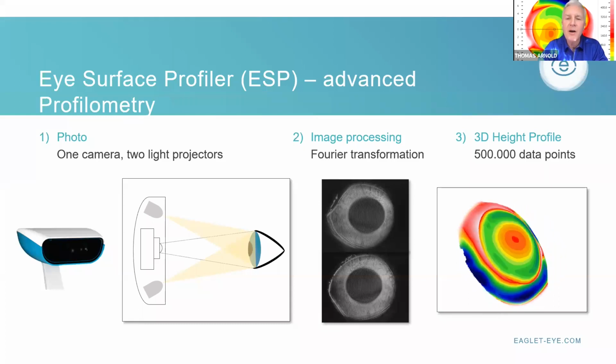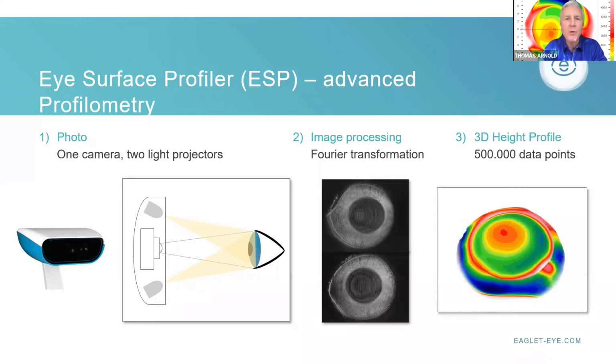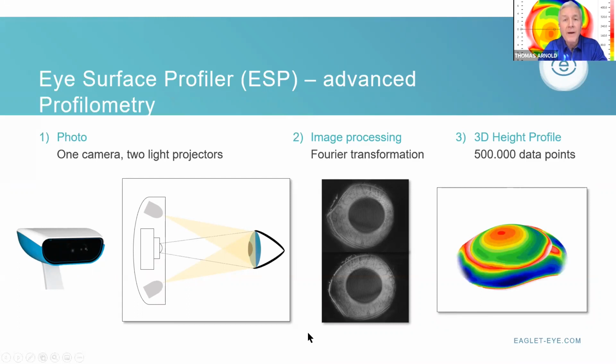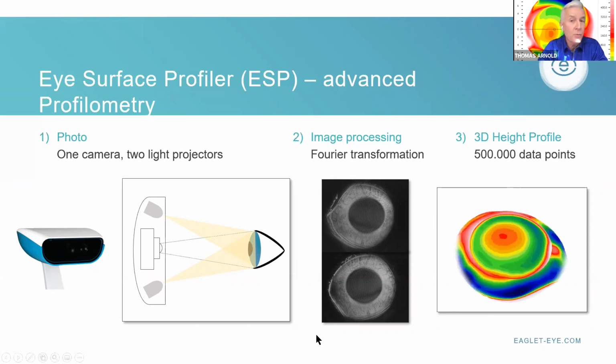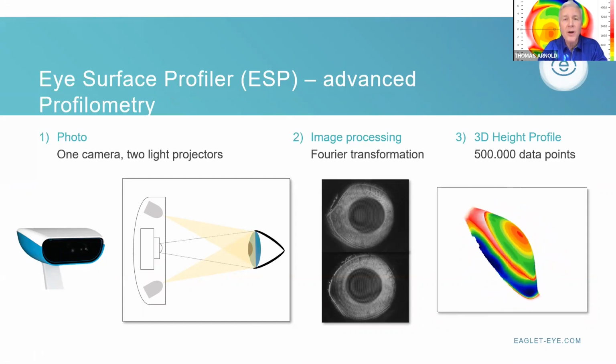So you spend a lot of time trying to figure out, well, how am I going to fix this, why isn't this lens centering, and why isn't this patient comfortable? And looking at this image, right off the bat, you see the complexity of this patient, and you can have an intelligent discussion with them and say, the standard lens may not be right for you, Mr. and Mrs. Patient. You're more complicated, and we have the tools to work with you, but just let them know up front what the journey's going to involve.